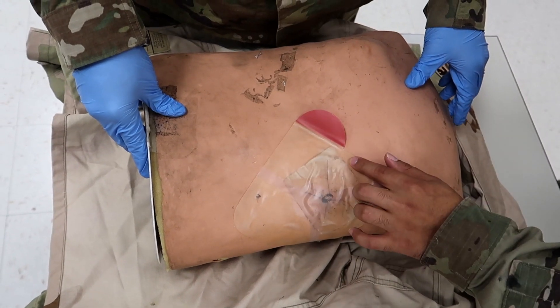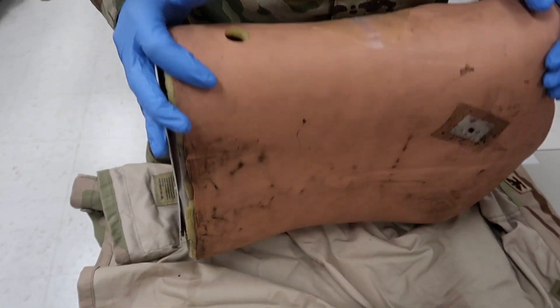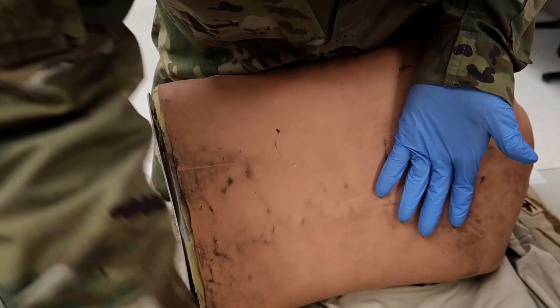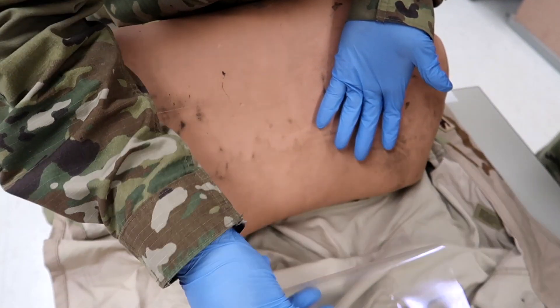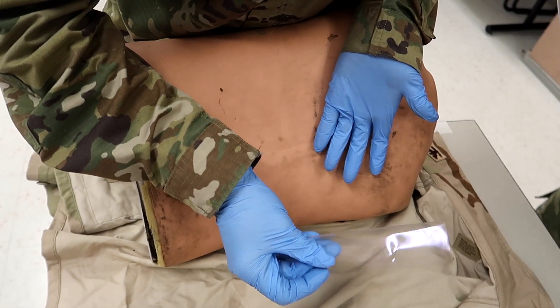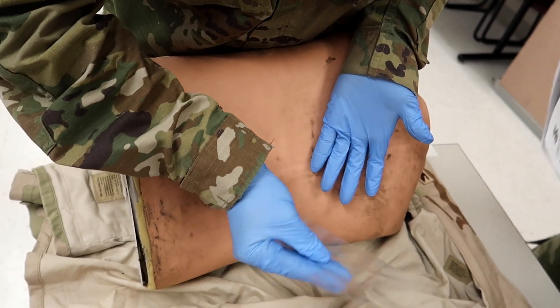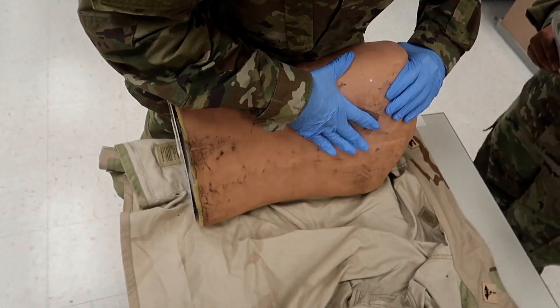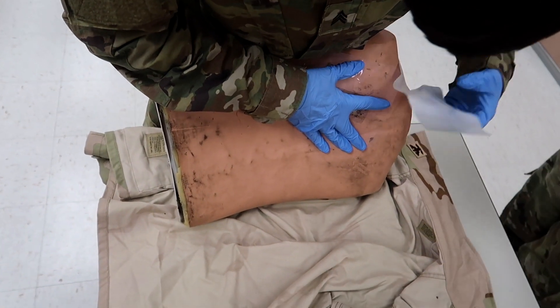Now that the commercial chest seal is placed and extended two inches across, he's going to log roll the casualty — or if conscious, stand them up — and examine the back for an exit wound. If present, he covers the exit wound on expiration with a large occlusive dressing. You can use the wrapper from the original dressing or any non-porous material as an improvised chest seal. On exhalation, he applies that to the exit wound.